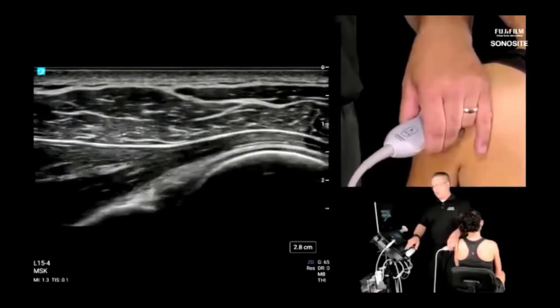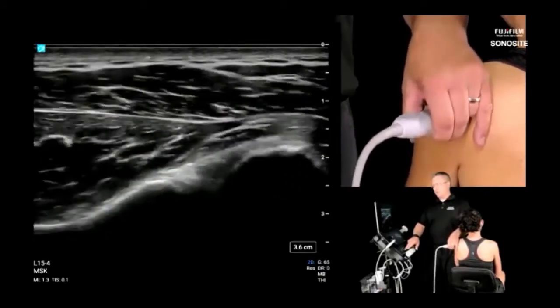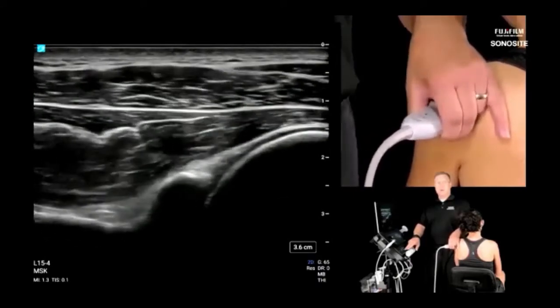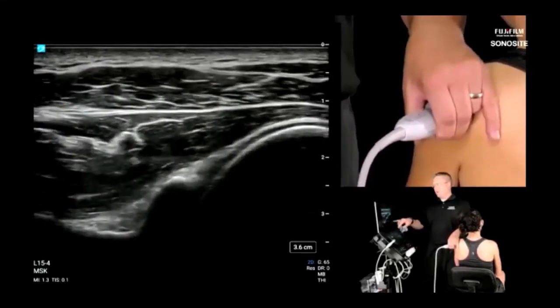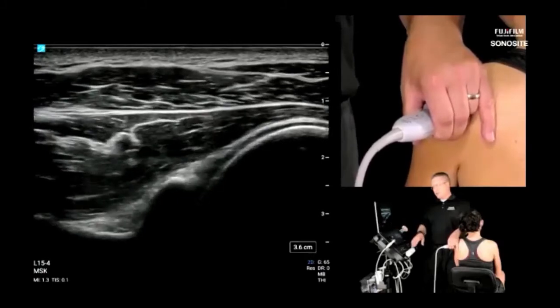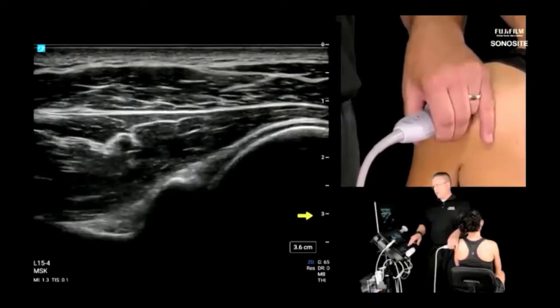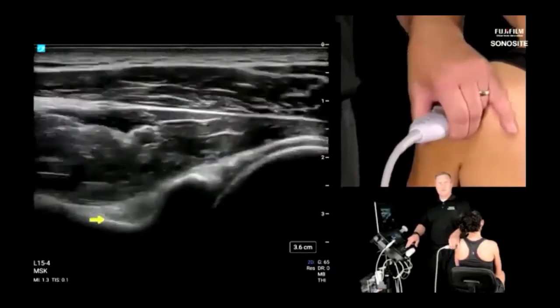And I was once told that you can just about reach everything on the extremities with a 1 inch needle. So you should be able to scan just about anything at 1 inch until the body habitus starts to get a little bit deeper. But spinoglenoid notch, for example, is 3 centimeters. You can see the centimeter hash marks on the right side of the scanning image. If you're not seeing those, let me pop my trusty arrow up. This is 3 centimeters. So in this patient here today, the spinoglenoid notch is roughly 3 centimeters deep.